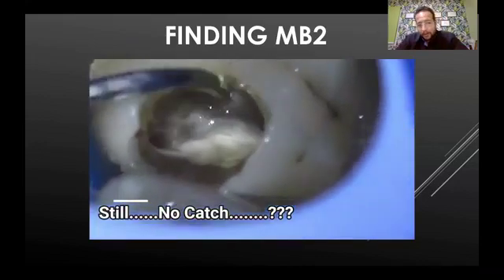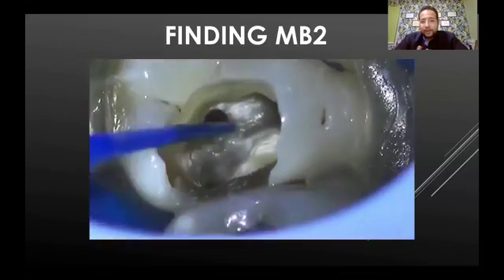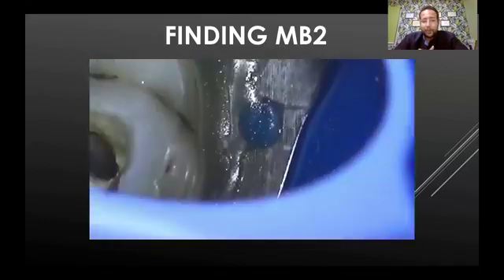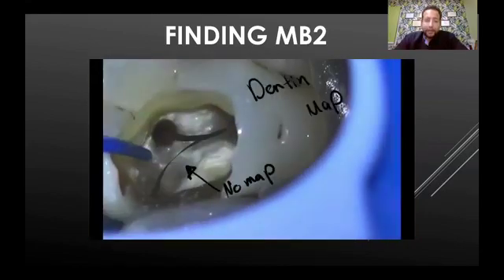As you see, I really destroyed some dentine here. So I did my best. There is no MB2 here. You can only be sure if you have CBCT, but you try your best.